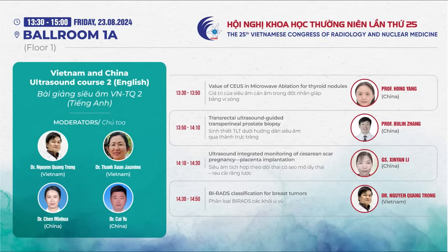transrectal ultrasound-guided prostate puncture biopsy is a procedure with high safety and effectiveness, with particular advantages in the detection of anterior prostate tumors.